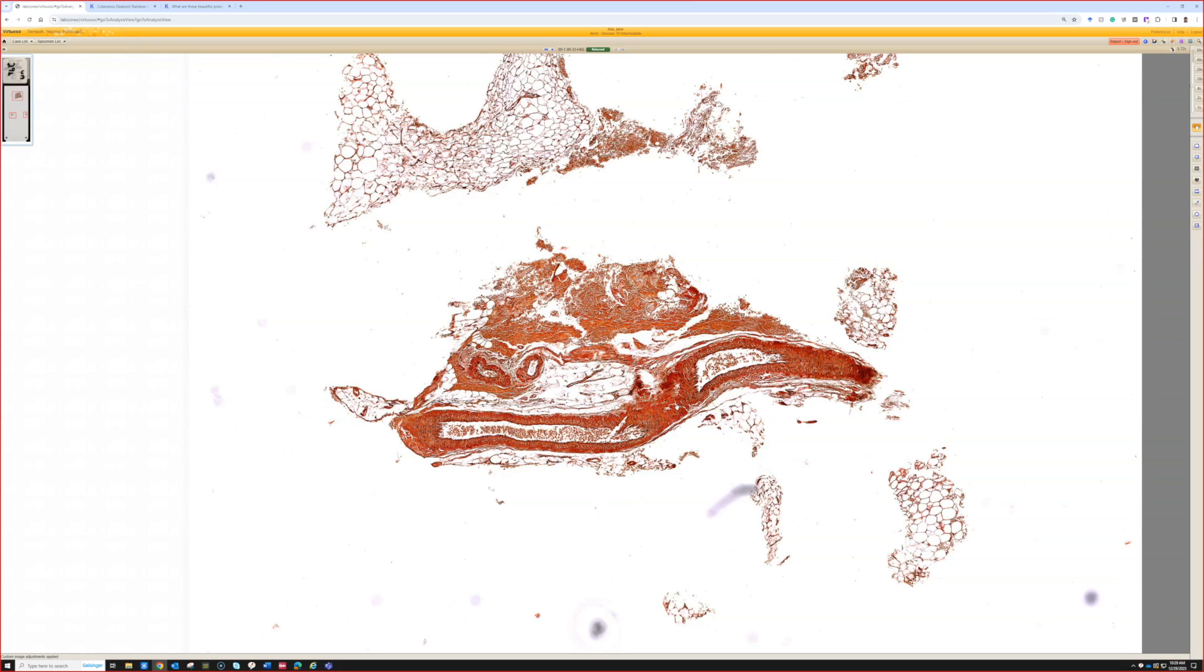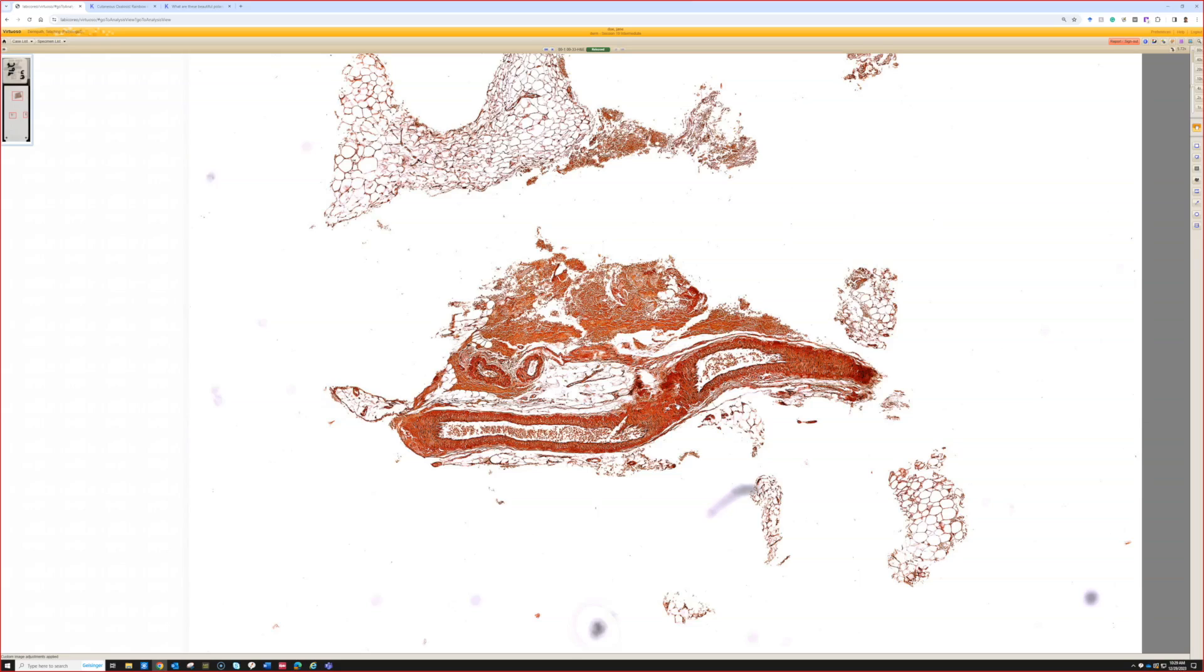Sometimes it presents as a mass clinically and it'll get removed as rule out lipoma. So it's not like this, it's like the best ever amyloid you could imagine, not this kind of subtle focal finding. That kind of amyloid you can see there when it makes like a big mass of extensive amyloid deposition. You can see that in the abdominal fat of patients with diabetes from insulin injection.